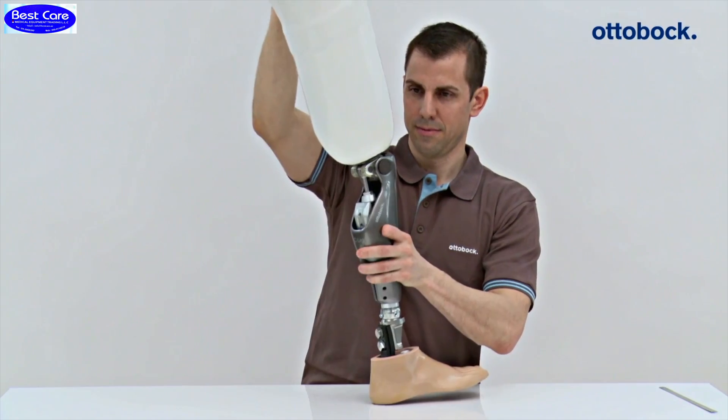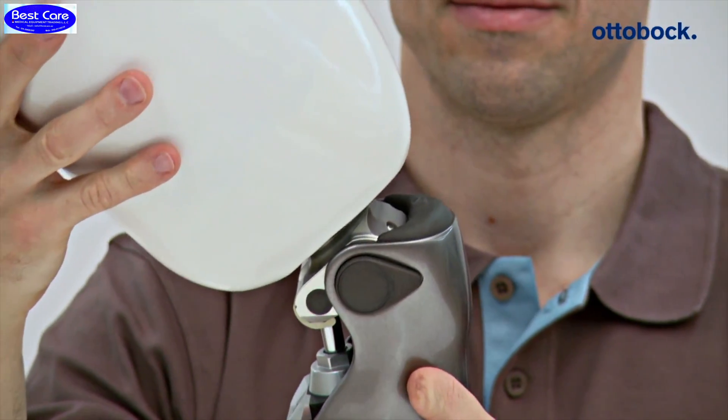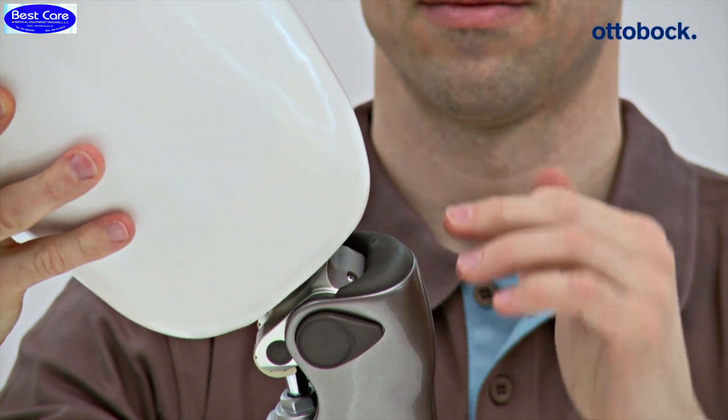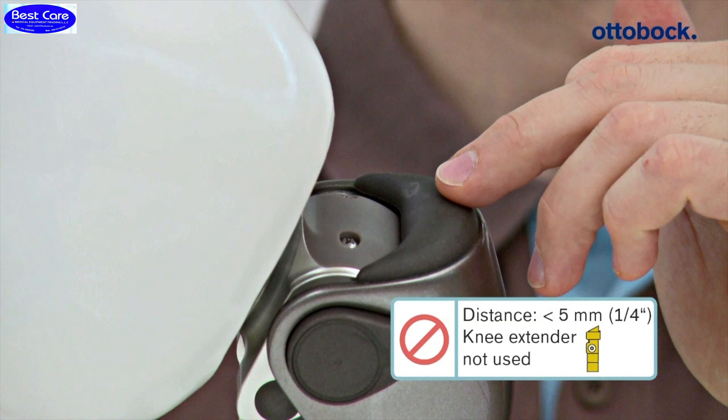In conclusion, the distance between the socket and main electronics must always be checked when a knee extender is being used. If the specified minimum distance is not maintained, readjustment of the distal socket area is required at a minimum.